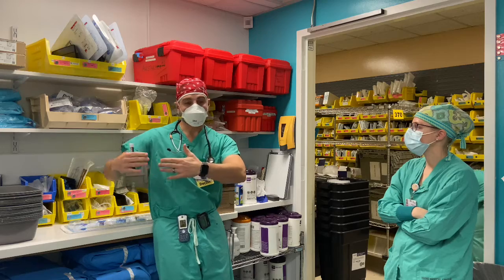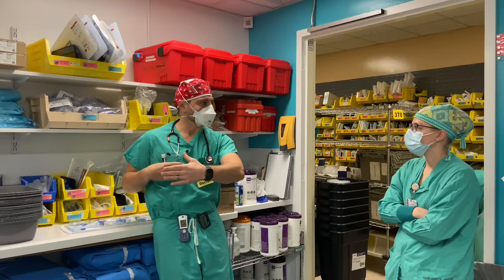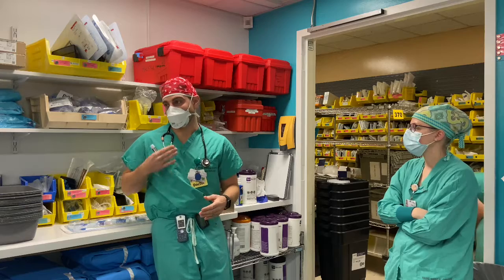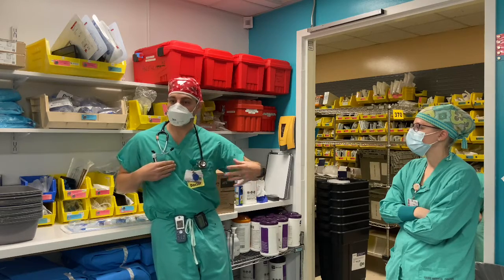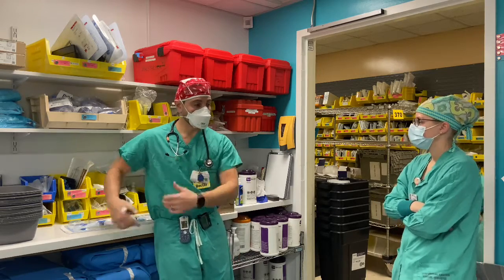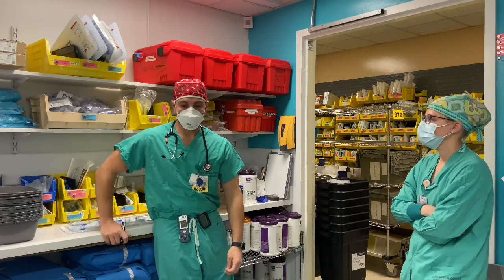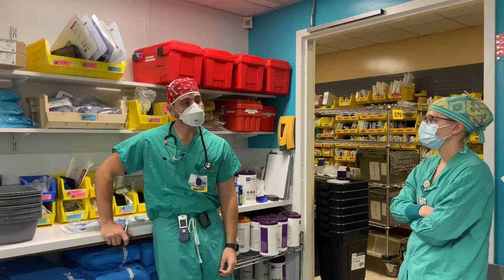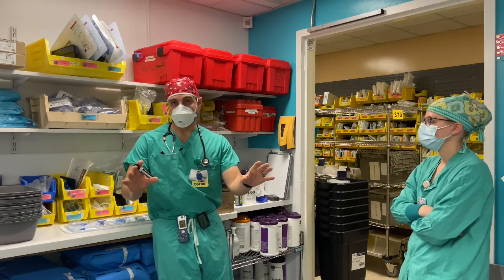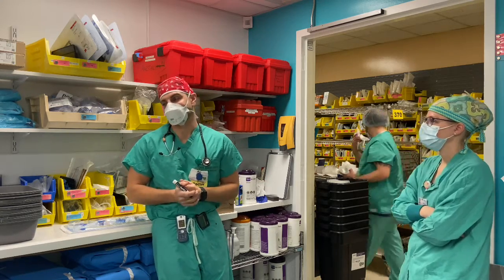So for the most part, you let a lung just deflate when you're working on that side, but to let it deflate, you need to stop ventilating it. You can't just stop ventilating the whole patient, but you can in most cases stop ventilating one lung, let it deflate, and just continue ventilating the other side. Some thoracic surgeons will actually blow carbon dioxide into the pleural space to get better visualization, so it's not like we never do that. But for the most part, isolating the lung, meaning breathing selectively for one side or the other, and dropping the lung you're going to be operating on is what the surgeons need to be able to see what they're doing.